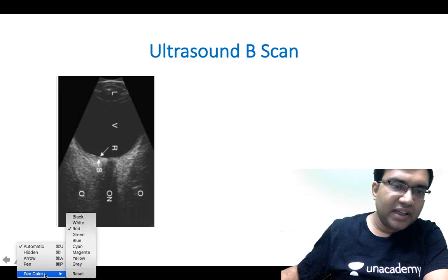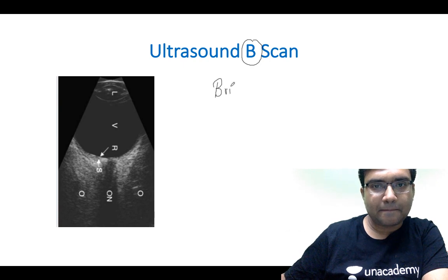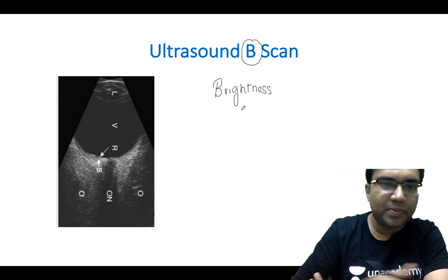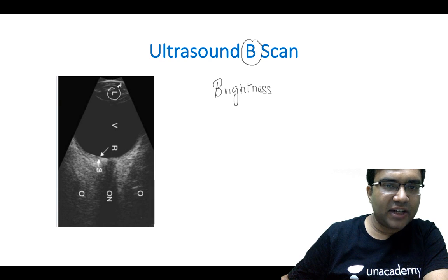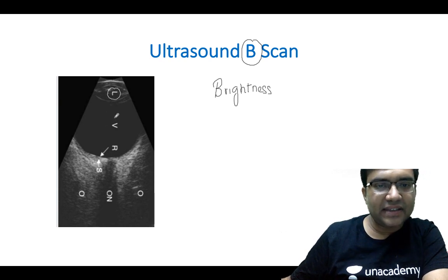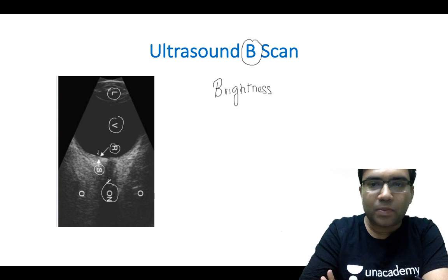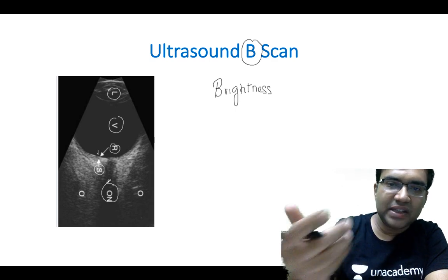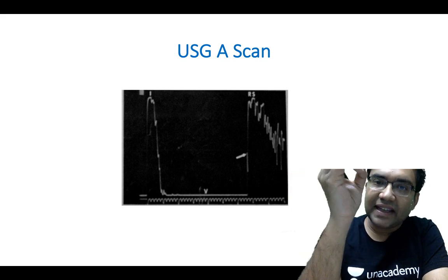The 'B' in B-scan means brightness. In the B-scan image you can appreciate the shadow of the lens, then the black area which is the vitreous, followed by the layers — the retina and the sclera. The black shadow you see here is caused by the optic nerve head. This basically shows a B-scan of a normal eye.